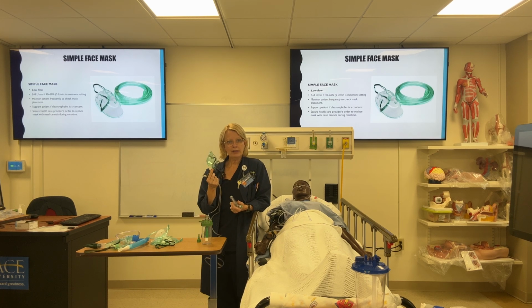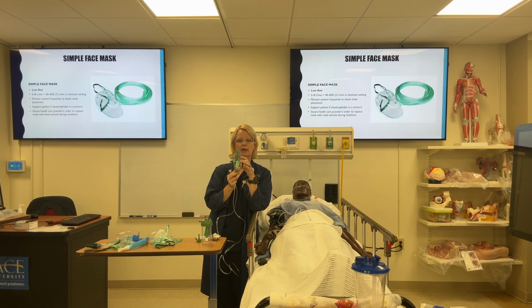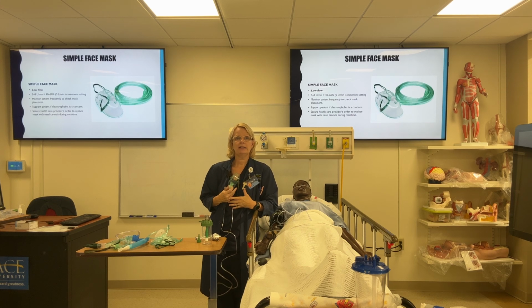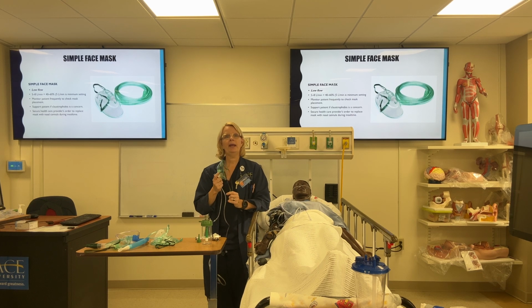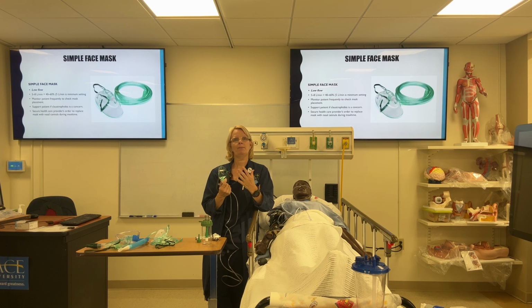Now, there's another reason why I might put somebody on a simple face mask even though they're oxygenating just fine. They're not having any issues with their oxygenation in terms of any underlying condition, but these are the patients who are mouth breathers. A lot of times I would get patients out of the operating room into recovery and the patient's still sleeping.